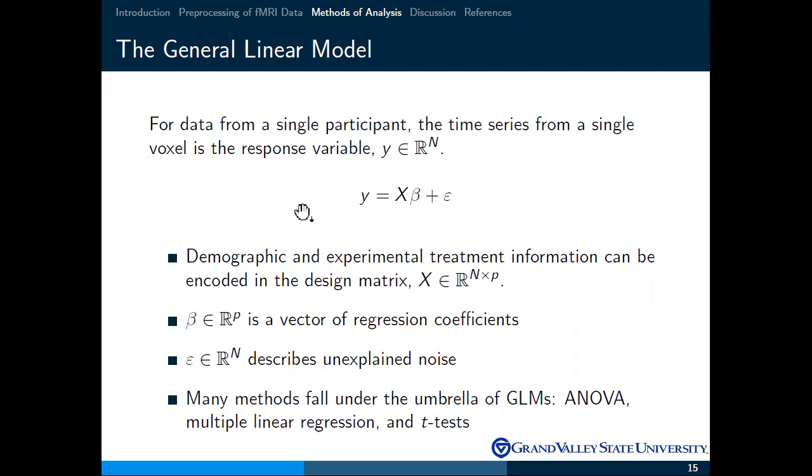If you want to compare across multiple subjects, you ideally would need a mixed effects model as well, to account for subject or within-group heterogeneity. So this is oversimplifying a bit, but those would be the ideal routes you would take in analyzing it with this approach.